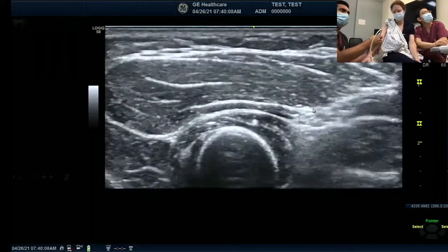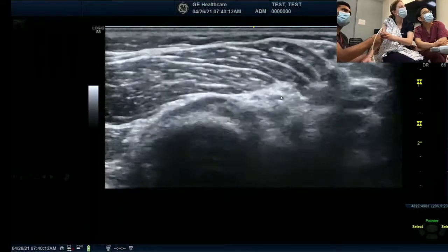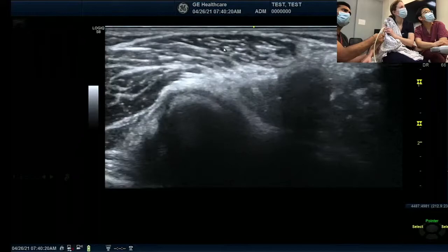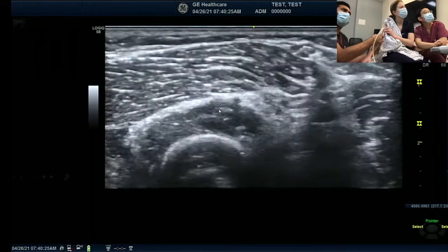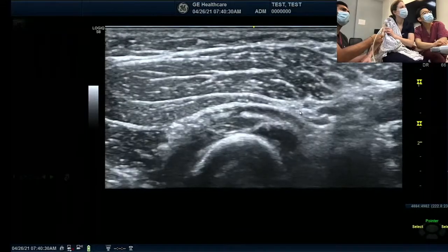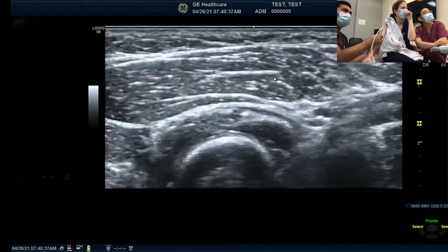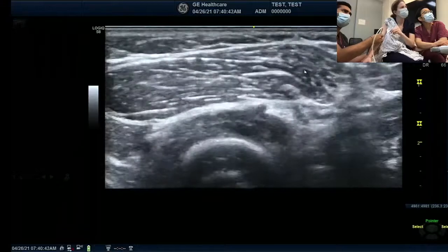I think we lost it. Here? Oh, here. Can you go back? Now you're going to follow these two muscles, ECRL, go fast. That's weird. Is it up there? It shouldn't be this one, it should be between here. This is the brachioradialis, this is the ECRL. So it should be around here. Can you move continuously in between so we can find out?